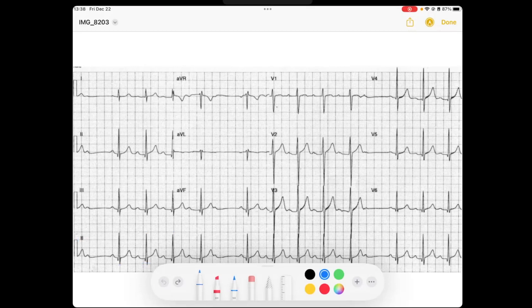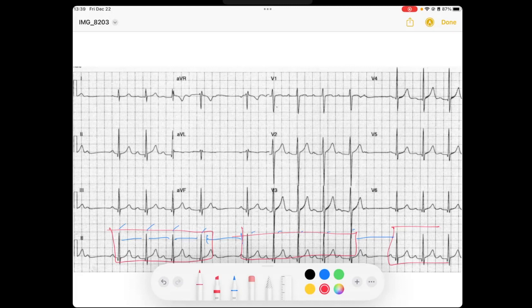Let's get started. When I begin, I like to look at what I call the forest and the trees. The trees are my QRS complexes, and I see a narrow complex rhythm ticking along. It seems to be somewhat regular, and then something changes. It looks to me like there's group beating — a group, then a pause, then a group, then a pause, then another group.